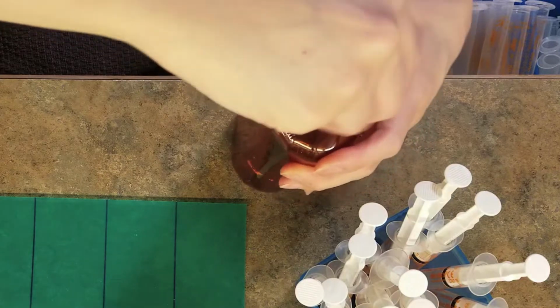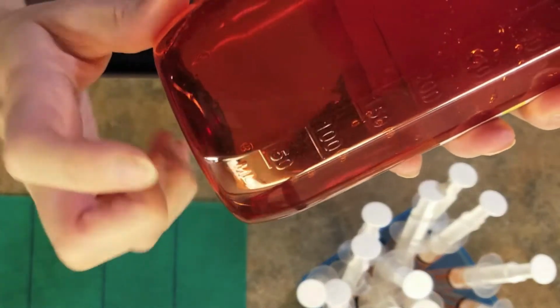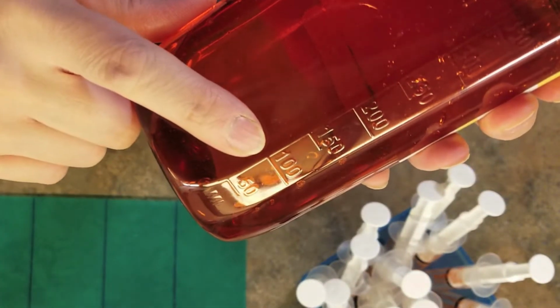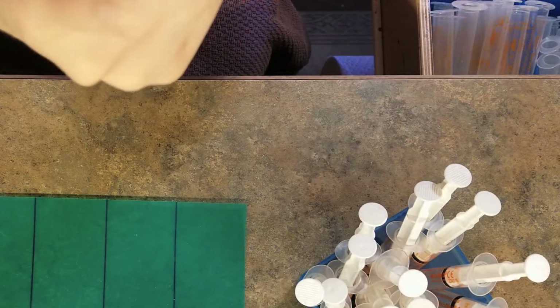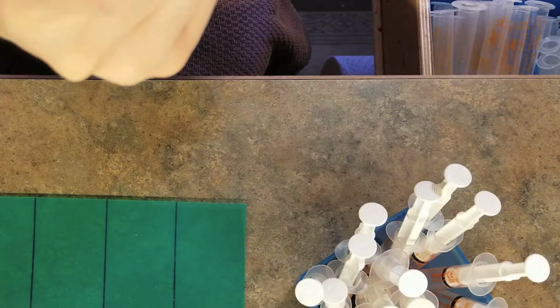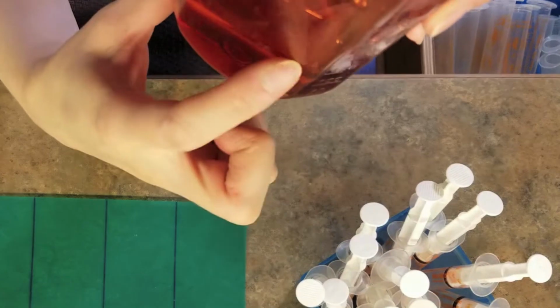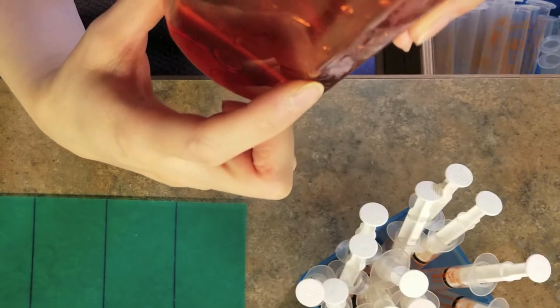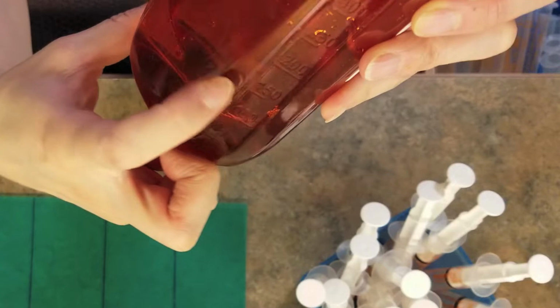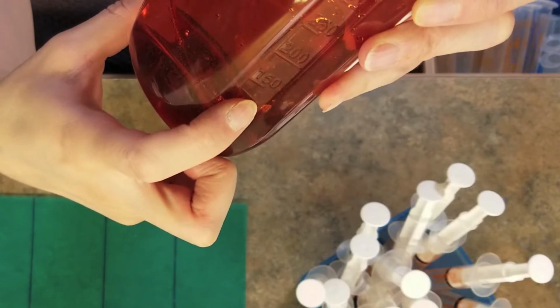The other thing I will do while prepping meds is I will check to see how much is left in the bottle. The pharmacy asks us to order things 10 days in advance. So I've marked what 10 days left of any medication is, so when it's past a certain line, I know when to order another bottle. It's very handy. The bottles you get from the pharmacy should indicate those numberings. It's a little hard to see, but it'll show you the milliliters on the side.